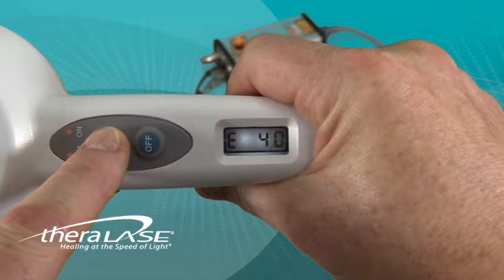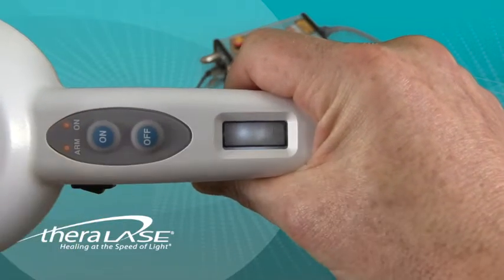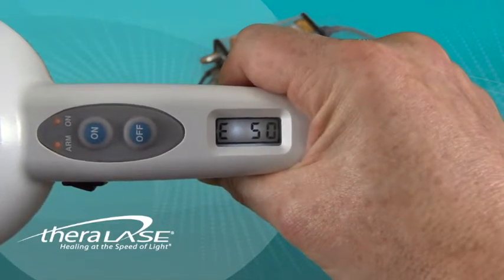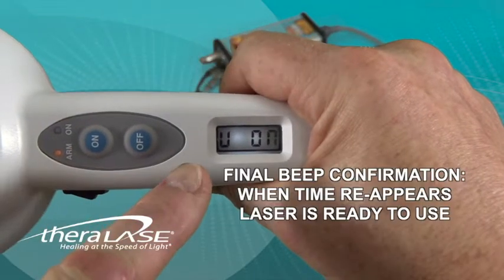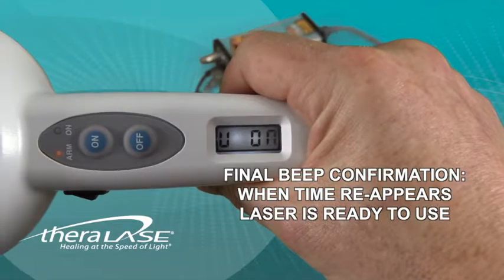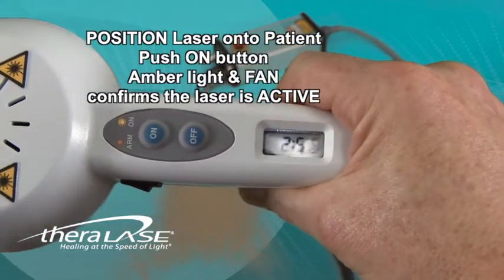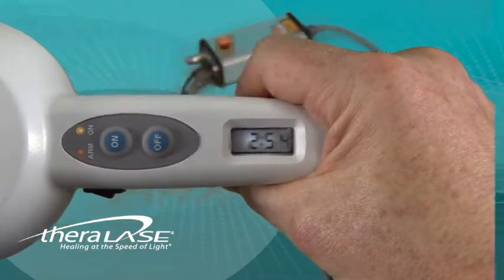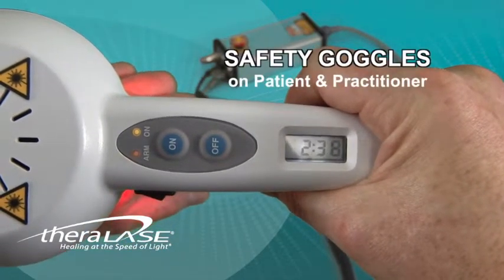Personal preference is the guide, and if your model does not have TENS, then the LCD will simply advance to the U — which is actually a computer-generated V — standing for volume. If we turn the volume off, then we won't have the benefit of the beep as a guide, so usually we leave the V in the on position. When the time reappears on the LCD screen, position the laser on the patient and press the on button to start the laser.